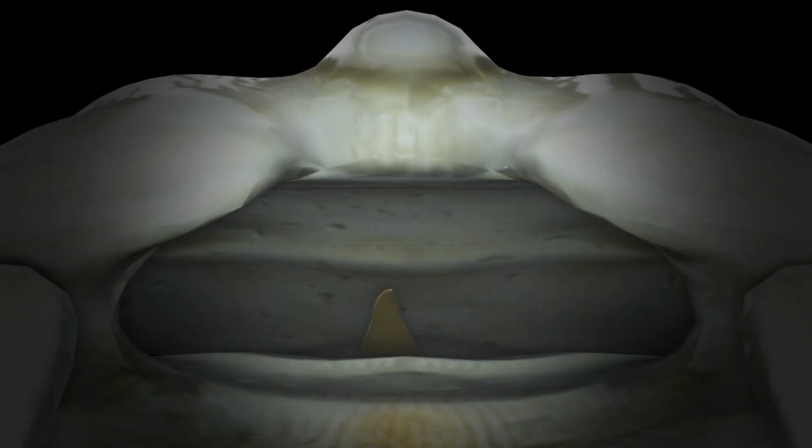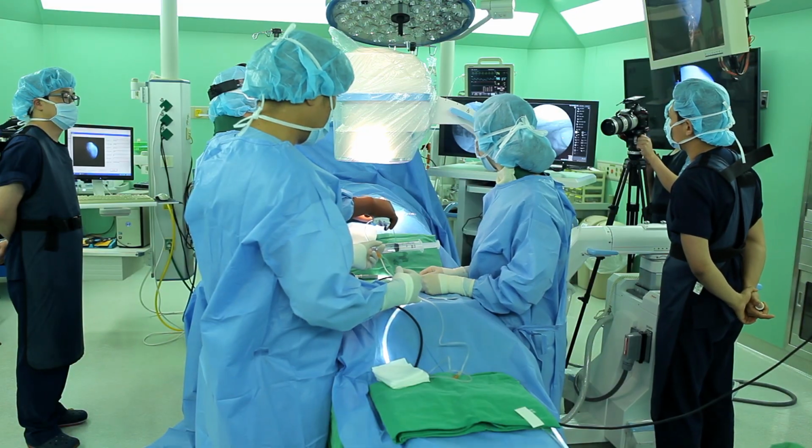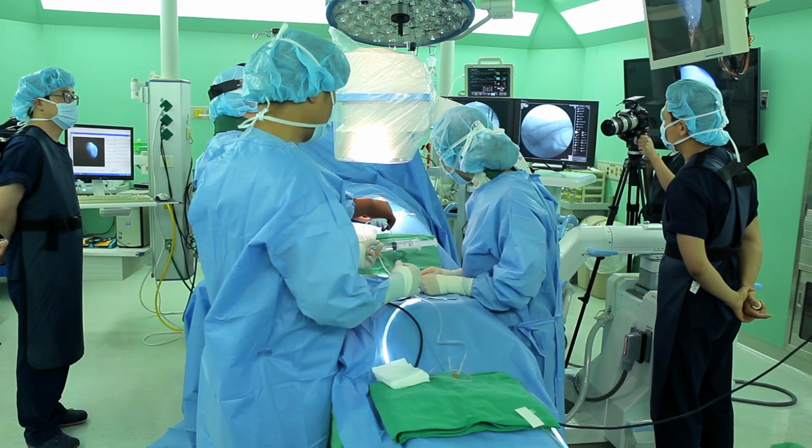The catheter trajectories are decided by each patient's different caudal canal and spinal canal structures, and by the three-dimensional structure of the lumbosacral angle and thecal sac. The ending point and shape of the thecal sac make an impact on the trajectory. You can reach the target point and check it with the C-arm.